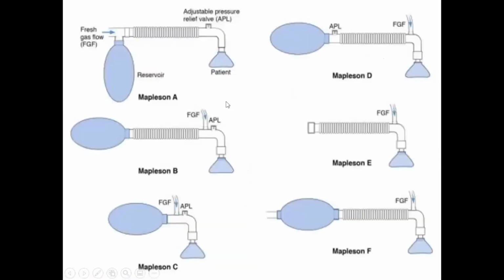Okay. Next, the most important part of this class is identifying the Mapleson system. I don't think anyone here can easily, if I give you a system, identify whether it is Mapleson A, B, C, D, E, or F. It's quite difficult.